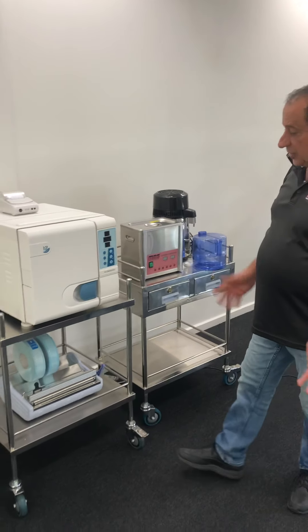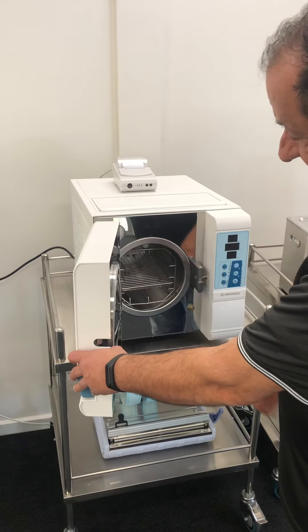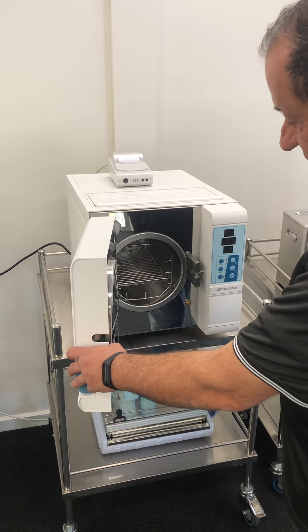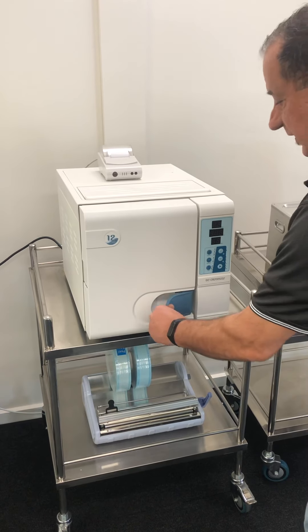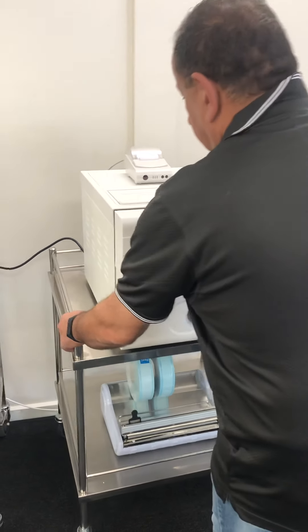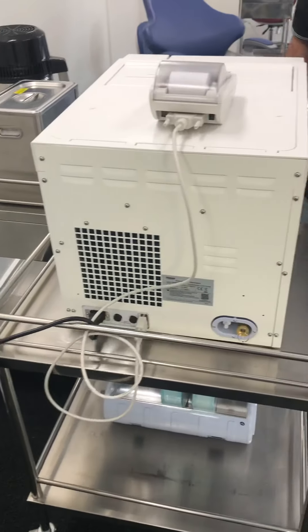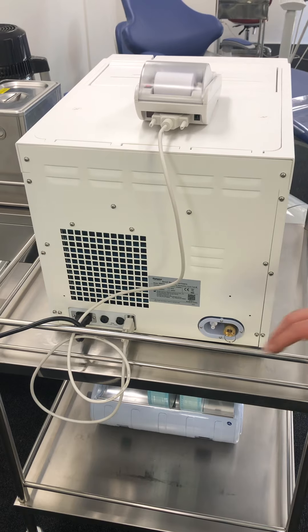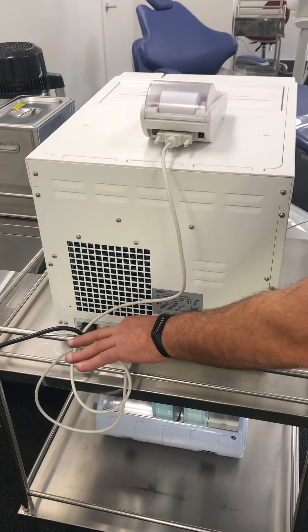Once the machine is on the bench and you've taken off all the plastic from the trays in the cage, and the machine is empty of anything else, the most important thing is the back connections. You've got your power supply and your printer — make sure that's plugged in at the back.